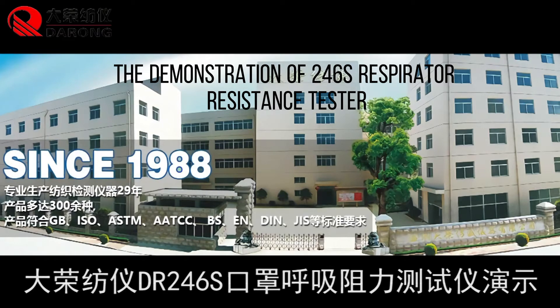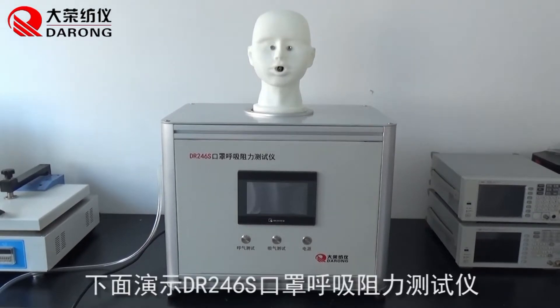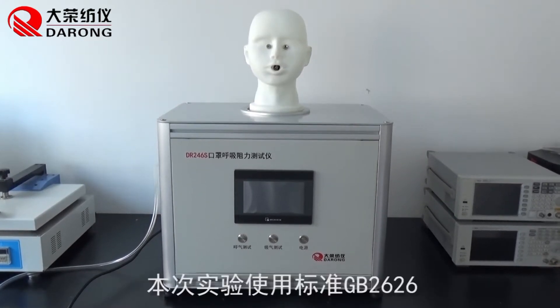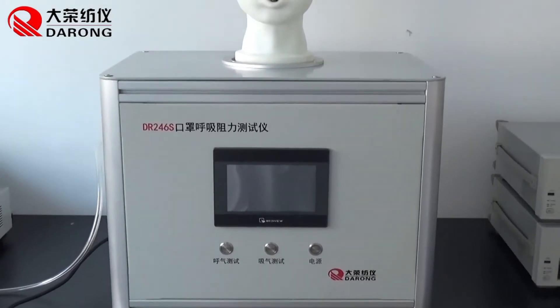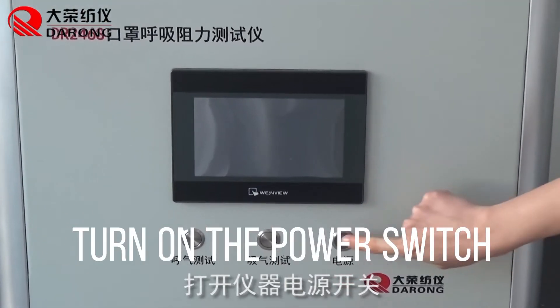This is the demonstration of the 246S respirator resistance tester. The language can be set to English. Testing standard is GB2626. First, turn on the power switch.